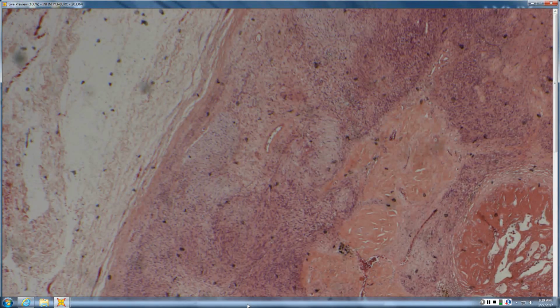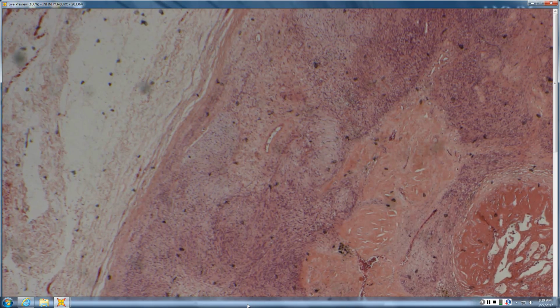So for a derm resident, I think a fair thing to ask you would be one that has Antoni A and Antoni B. For a dermpath fellow, you should be able to nail the ones that are soft schwannomas that are only Antoni B. And what they look like is a big, deep, round to oval encapsulated mass with subcapsular edema, and then less edema but edematous throughout, and no Antoni A. And that's what a soft schwannoma looks like.